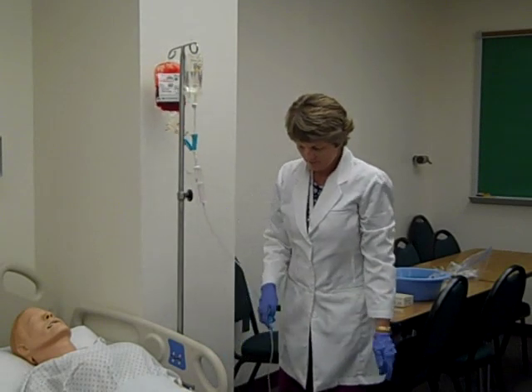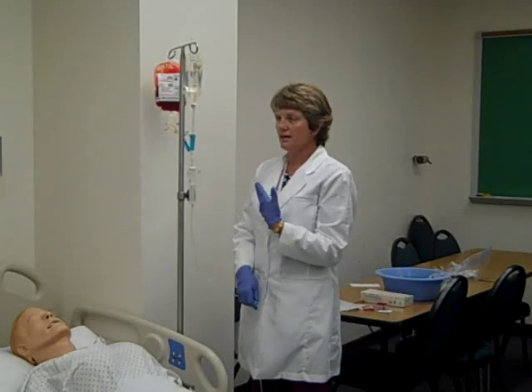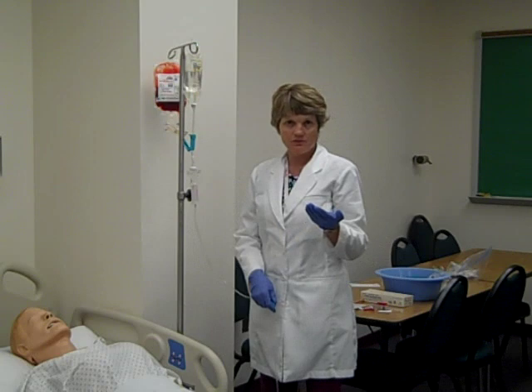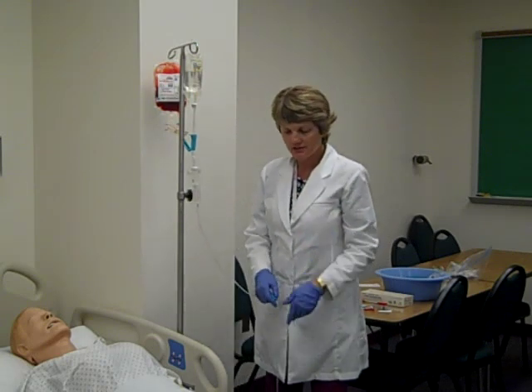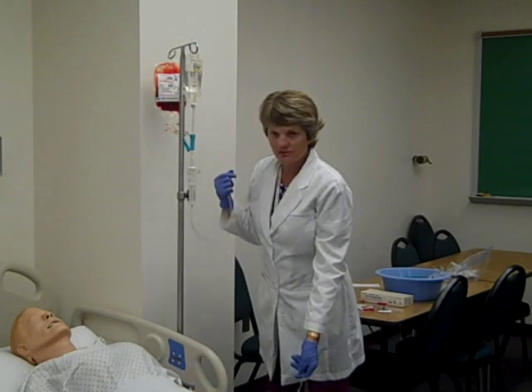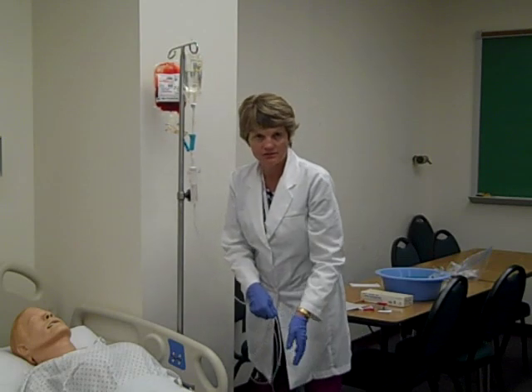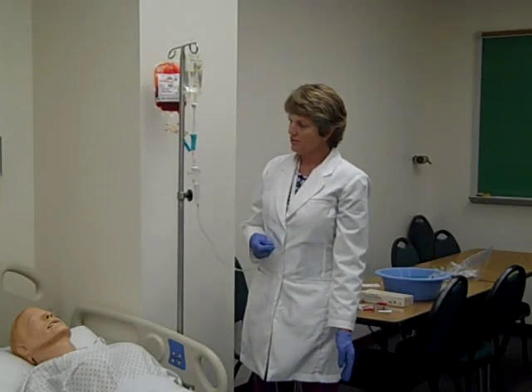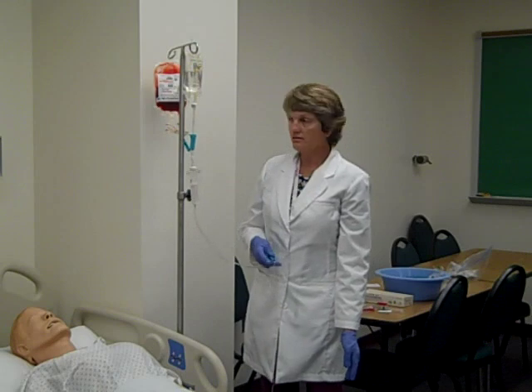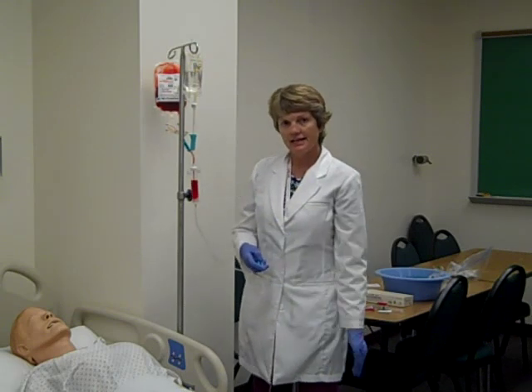At this point, and because blood is so cold, if we put the blood at the rate we want it to run for the first 15 minutes, which is about 75 milliliters an hour, it's going to run so slow that it's going to take lots of, like half an hour at least, to get down to the IV port. So what I'm going to do is I'm going to run it really fast. If you were using a pump, you could run it at 999.